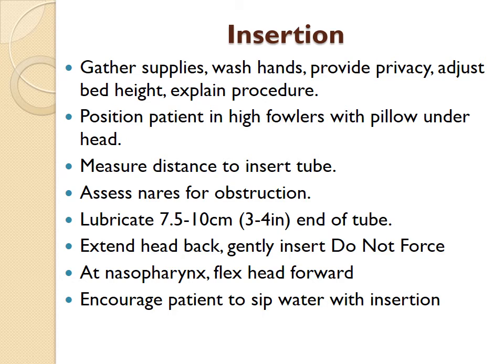You want them to hyperextend their head back. That allows for straightening of the oropharynx area. You want to gently insert. You never force the tube. So you want to gently insert the tube, aiming toward the floor, the nares, and allow it to begin to go down around the curve of the oropharynx.